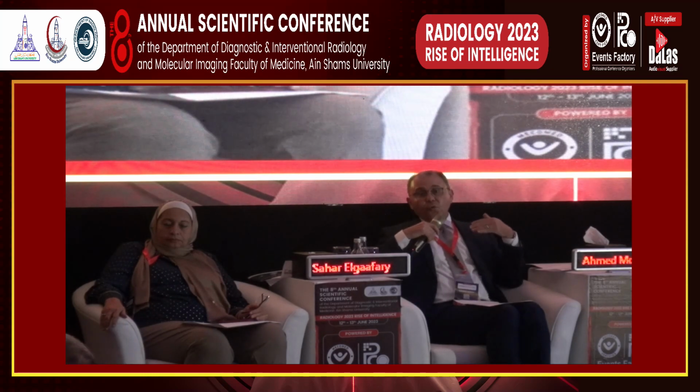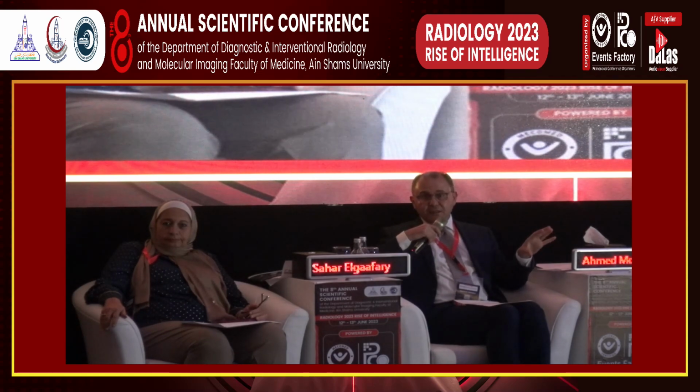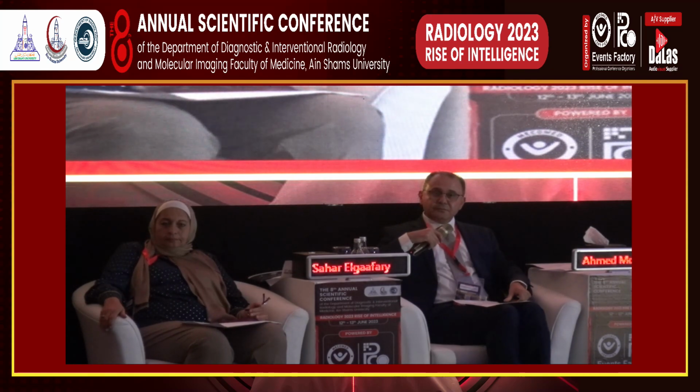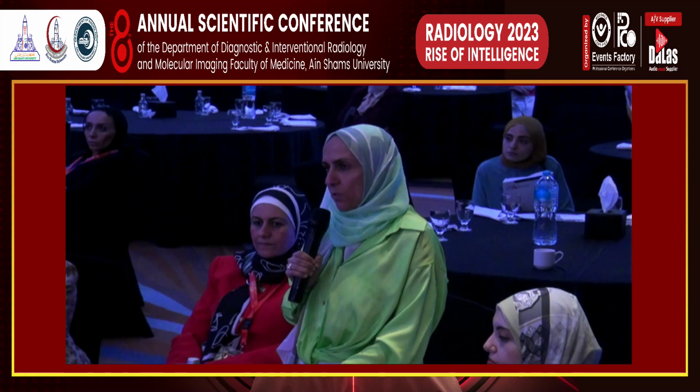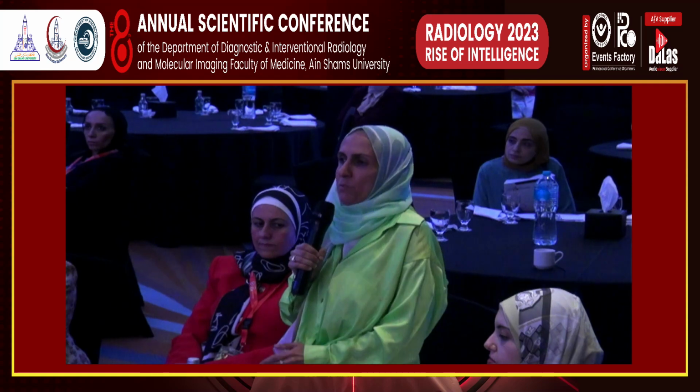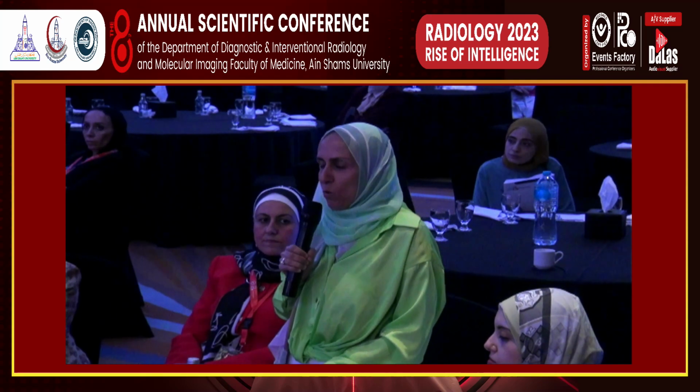طيب يعني إنت الريكومنديشن بتاعتك زي ما أنا شفت كده في الآخر إن أنا I go for بايبارامتريك و during الإكزام I can proceed أو أغير لمالتي بارامتريك according للداتا اللي أنا شايفها. يعني أي عيان جاي لنا بنبتدي بالبايبارامتريك if it's okay ماشي في الأول لغاية 3 إحنا شغالين بالبايبارامتريك، إذا كان 4 أو 5 هنخش على المالتي بارامتريك. هو 3 هو اللي بيحتاج المالتي بارامتريك. 4 و5 خلاص مش محتاجين مالتي بارامتريك بالظبط، لأن الديفيوجن لو حدد إن هو 4 الكونتراست مش هيعلّيه، و5 مش محتاج، بس هو بتبقى 3.